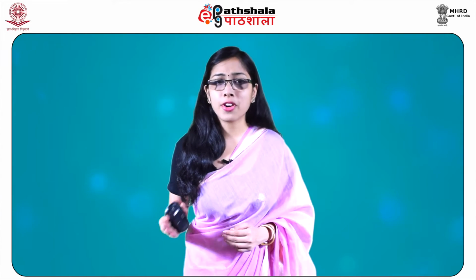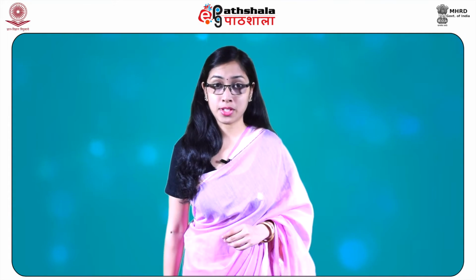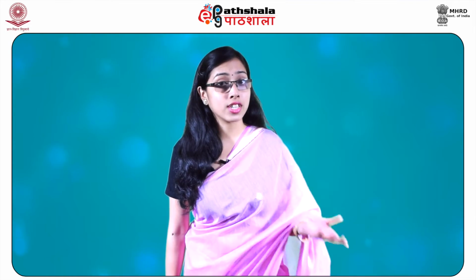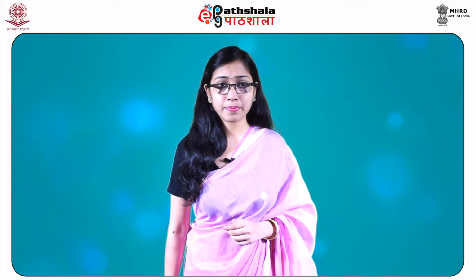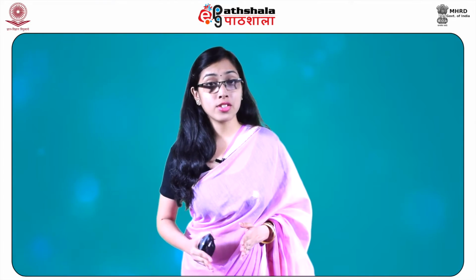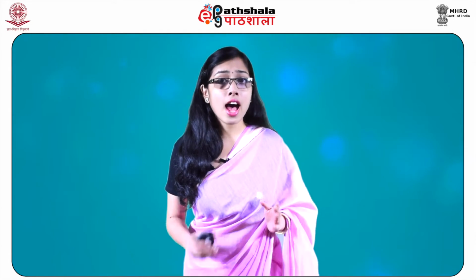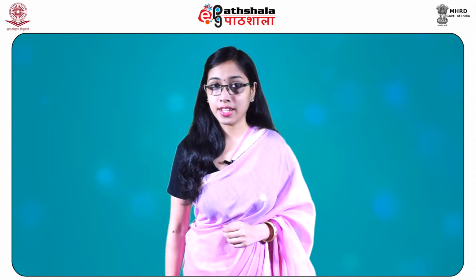They are simple to perform and no extensive training is required for this purpose. As such, they appeal in situations where laboratory facilities may be very limited, for example, in cases of the developing world. They can be performed in the field by police officers or technicians, require minimal reagents, are inexpensive and give immediate results that can be viewed by the naked eye.